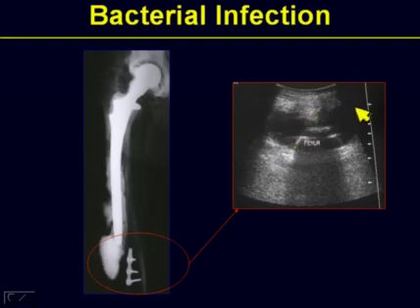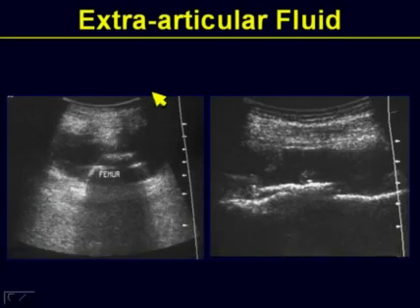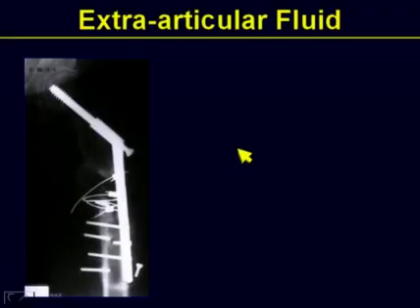Case in point, in this individual, you could see the prosthesis and an abnormal collection of fluid. So anytime we see extracapsular, extra-articular, but perifocal fluid collection along the prosthesis, that for us represents bacterial infection. Here you could note that a more difficult sampling of the hip is readily sampled in the distal portion on short axis and on long axis. Already you could see that while the callus formation might be buttressing enough, there may be an elevated portion, but it is abnormal fluid collection that we would target for extra-articular collections.